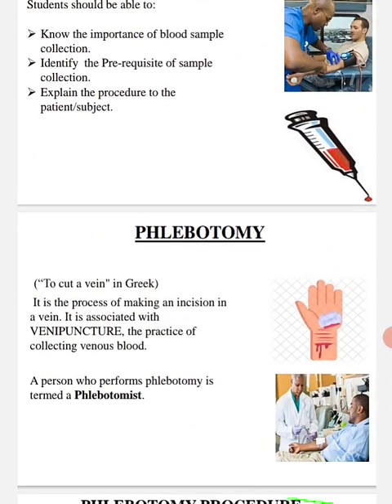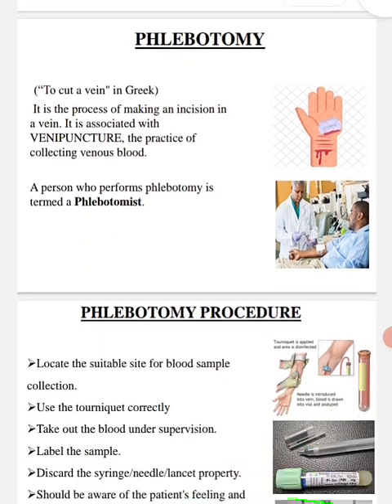Phlebotomy. What does it mean? To cut a vein. It is a Greek word. It is the process of making an incision in a vein. It is associated with venipuncture, the practice of collecting venous blood. A person who performs phlebotomy is termed a phlebotomist.